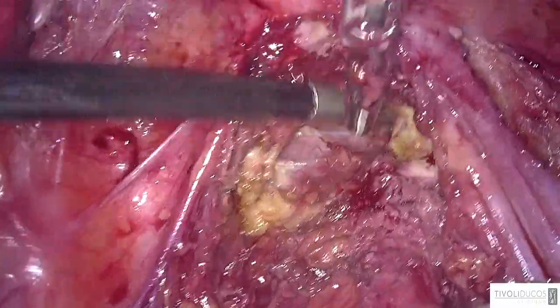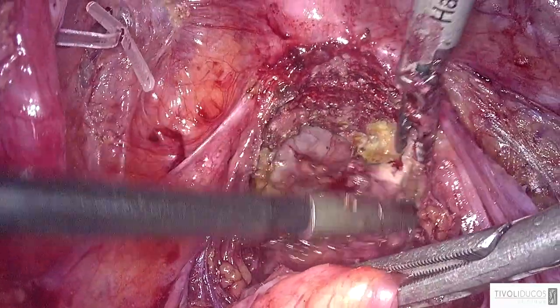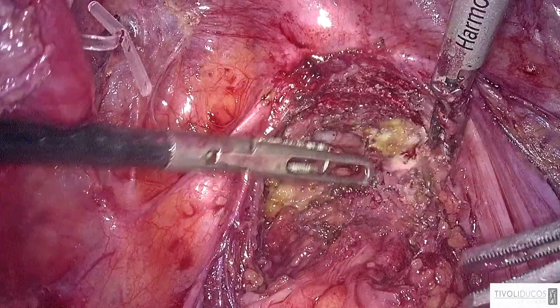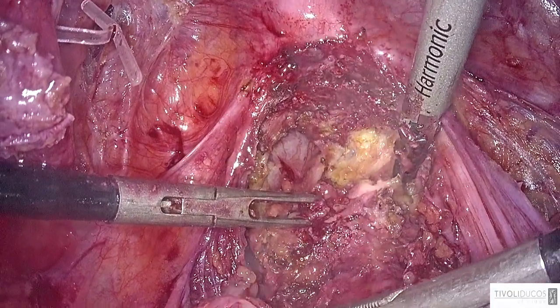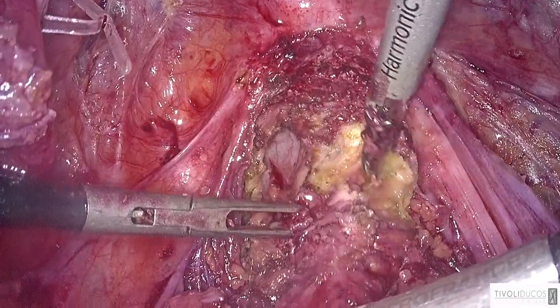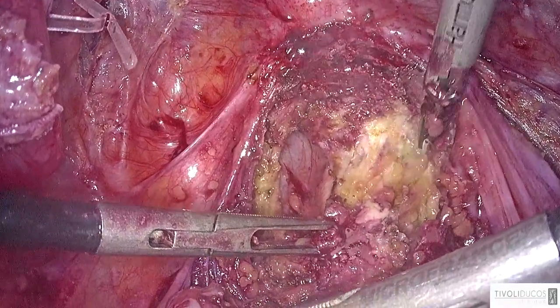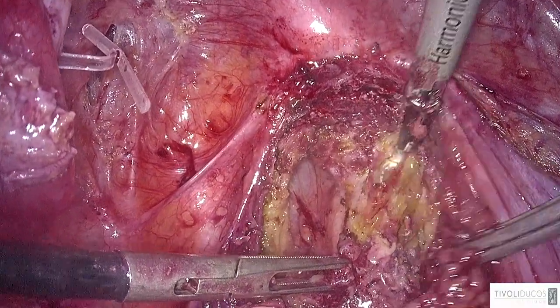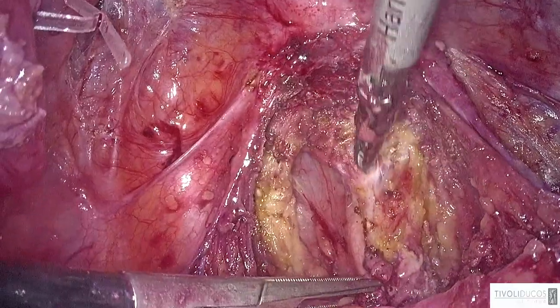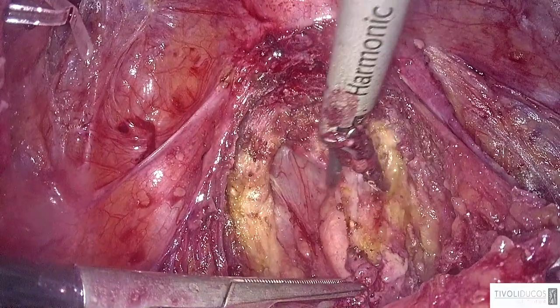You see? So, Horace, most of the surgeons, including us, me and Bülent also, and the others, go in this area coming from the lateral side, I mean, the right and left side. You went directly in the middle of the area. What do you think about that? Could you comment on that? This is your technique, of course.